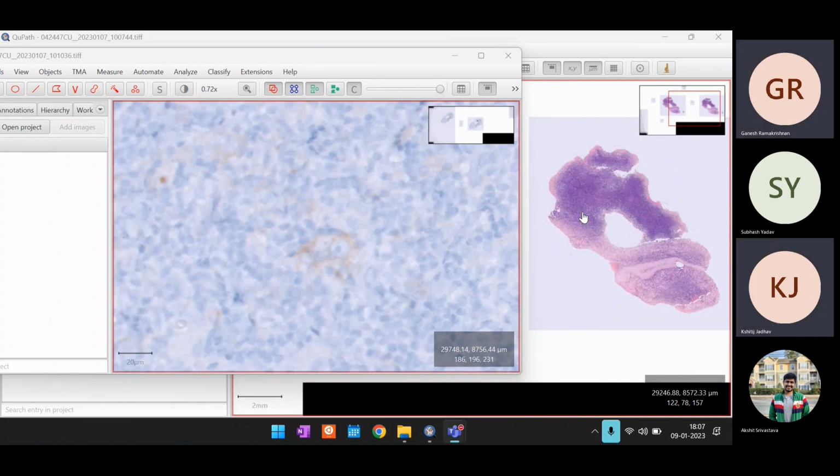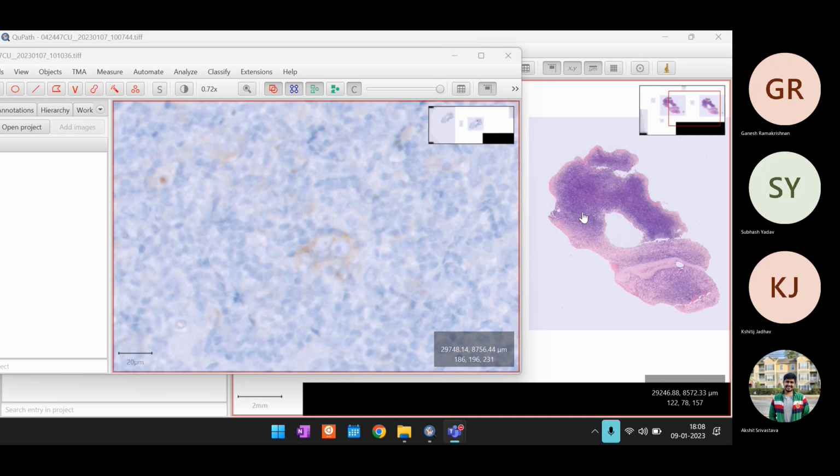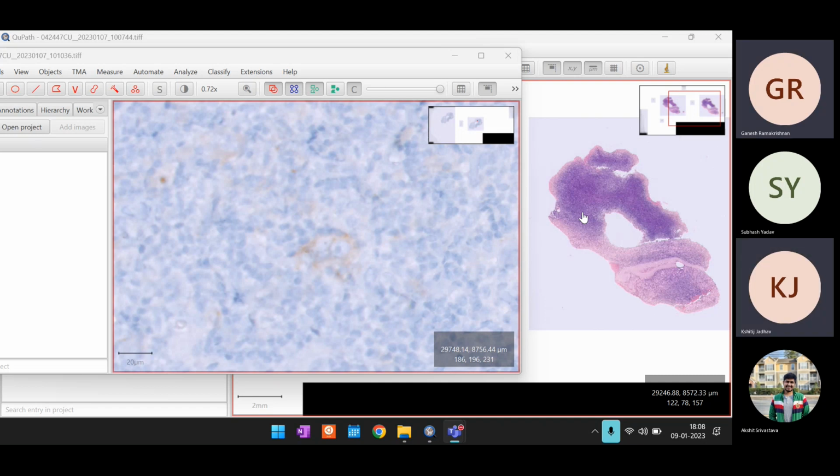Professor Ganesh, you're there? Also, we should keep in mind if we can instantiate multiple such labeling functions. That's when the consensus starts mattering, right? So the size will be one. The binucleated nucleus will be another. And the third would be the color of the brown colored cytoplasm.